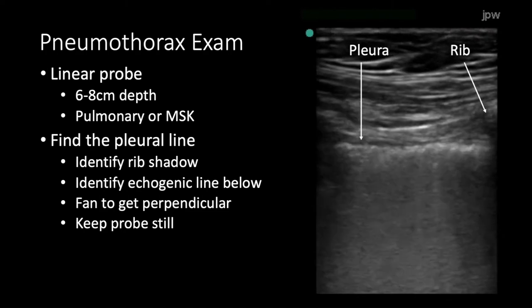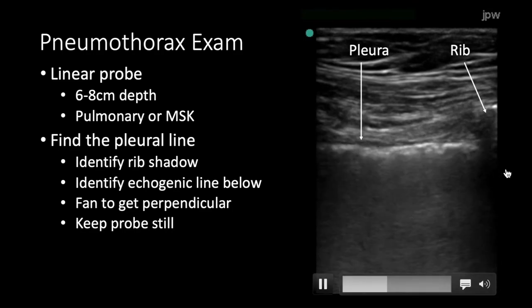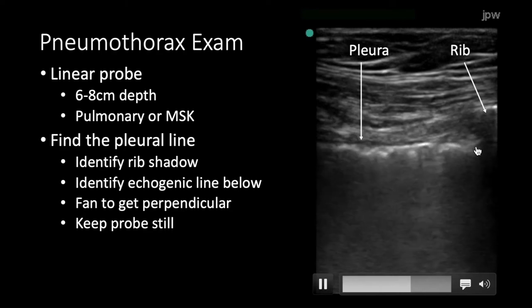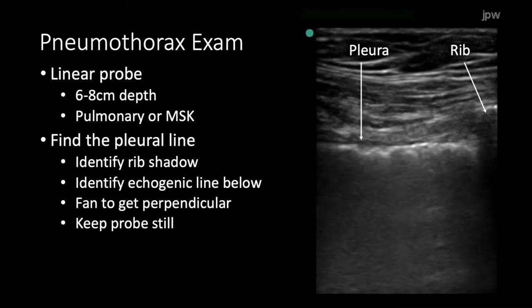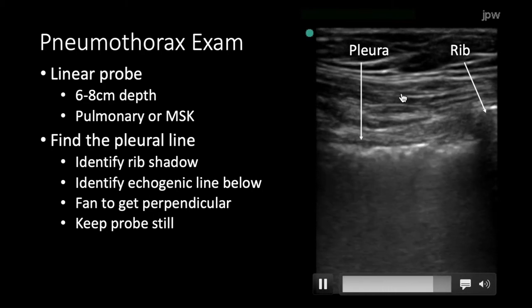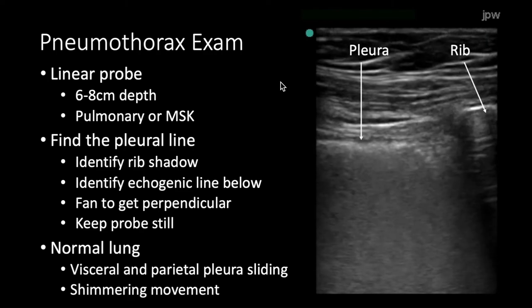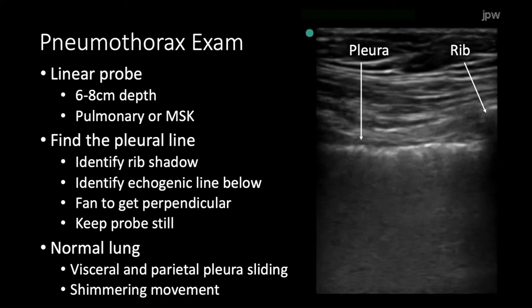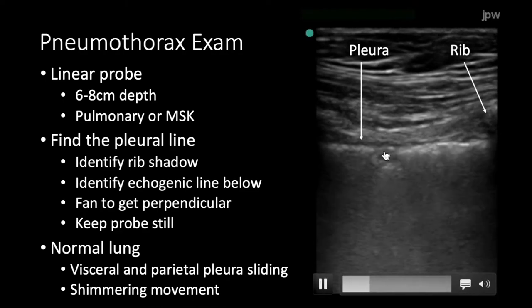The first step is to find the pleural line. I recommend identifying the rib, which will cause a shadow. Below the rib will be a bright white line — that's your pleura. You may need to fan to get perpendicular to it to bring it out. Then keep the probe nice and still so we can investigate whether there's lung sliding. Normally the visceral and parietal pleura slide against each other, and that movement can be seen as a shimmering — some people call it ants marching.